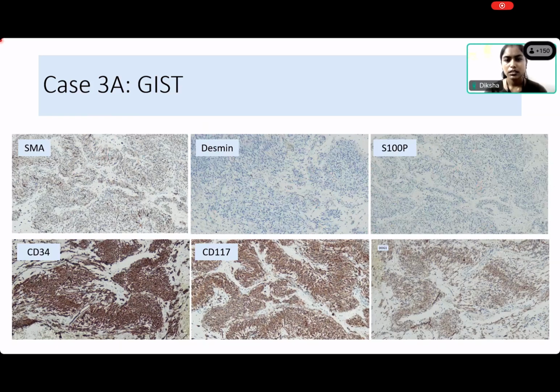Cluster of differentiation. So what is DOG1? What is this DOG business? Ma'am, it was discovered on the GIST. Yes, discovered on GIST, that's why it is called DOG1. So very good. The diagnosis was gastrointestinal stromal tumor, and it's not uncommon for a gastrointestinal stromal tumor to show palisading and to be cystic. These are not true cysts; they are pseudocystic tumors. So one should be aware that this is one of the issues.